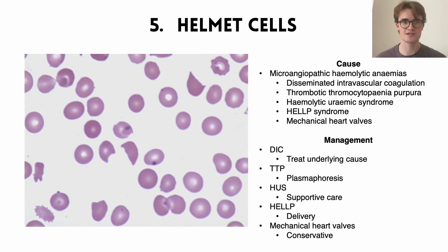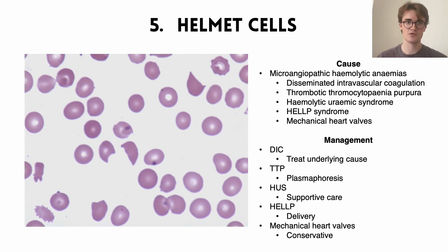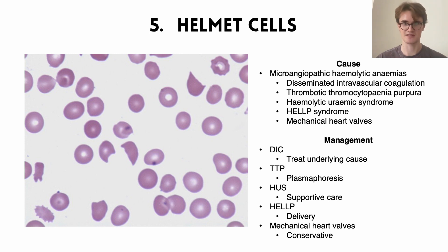The fifth blood smear presentation to know is helmet cells. Looking at this blood smear, we see normal red blood cells alongside some abnormal red blood cells that look like they've been chopped in half — like a helmet you could put on. This is due to the mechanical shearing of red blood cells by something in small blood vessels. In Latin terms, these conditions are called microangiopathic hemolytic anemias: small vessels causing the problem, red blood cells being broken down, resulting in reduced red blood cells and haemoglobin.